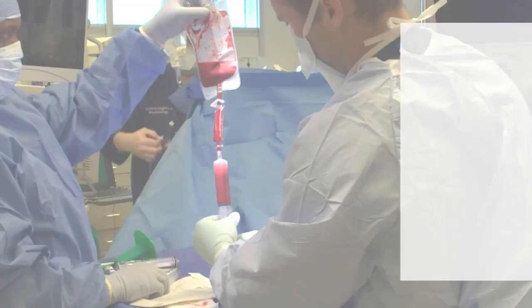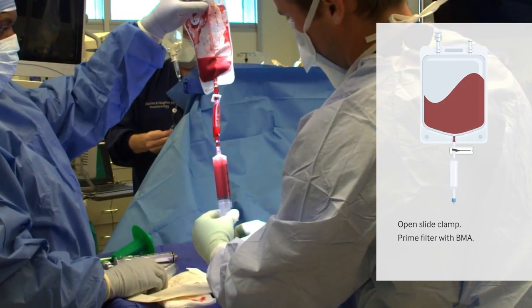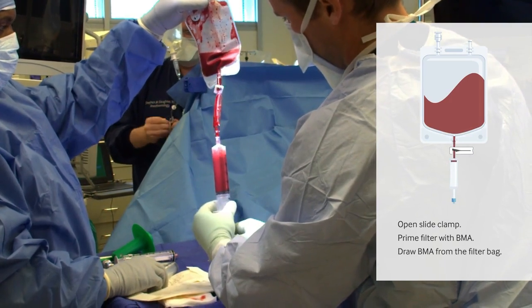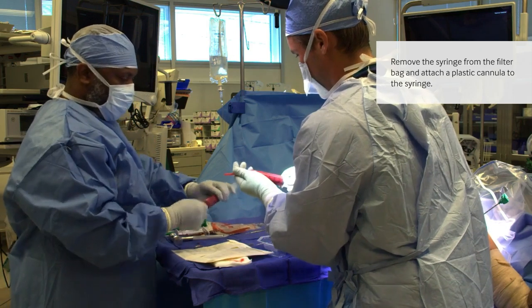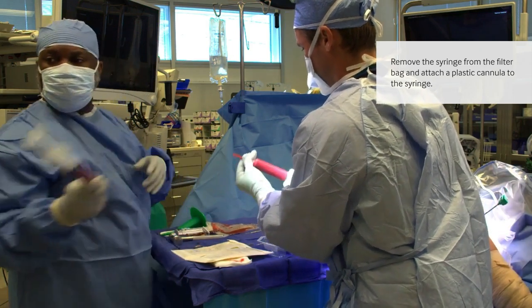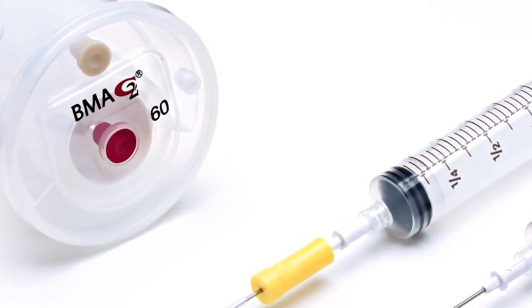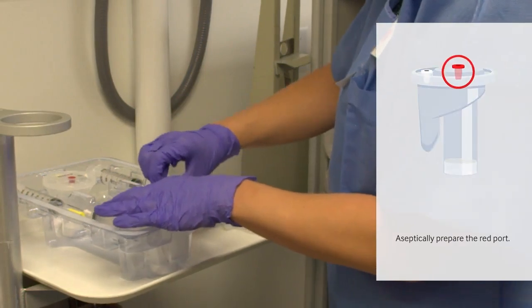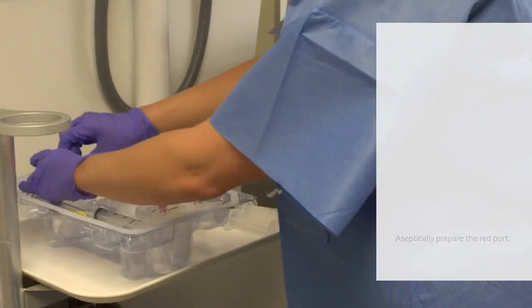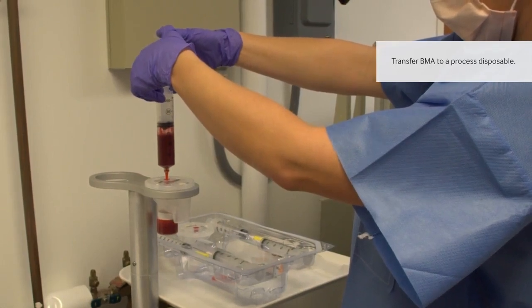Once enough bone marrow aspirate is collected, it's time to process it. Open the white side clamp on the bag and squeeze the filter chamber to allow aspirate to enter it. Remove the syringe from the filter bag and attach a plastic cannula to the syringe. Now transfer the bone marrow aspirate to a process disposable for easy processing. Aseptically prepare the red access port on the process disposable, then transfer bone marrow aspirate into the red port.